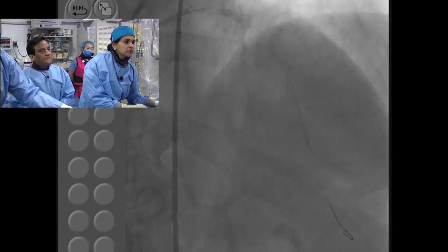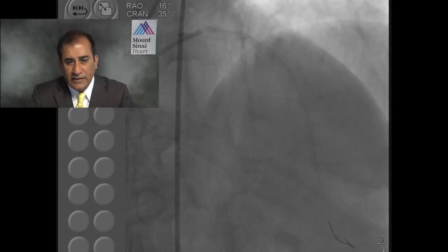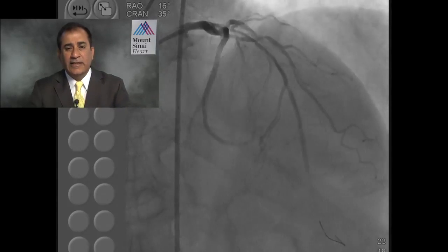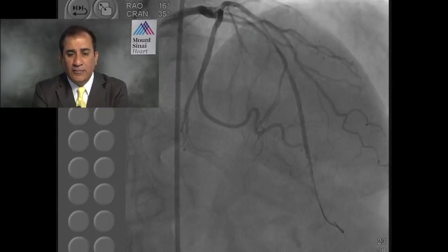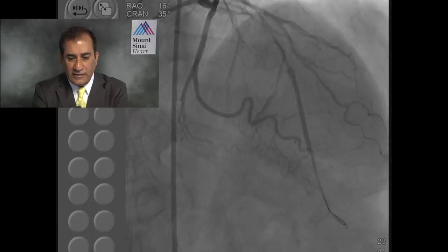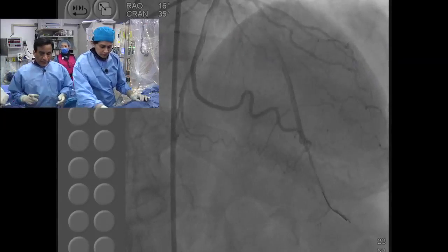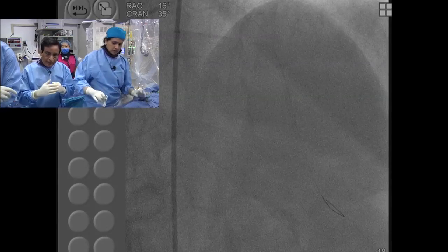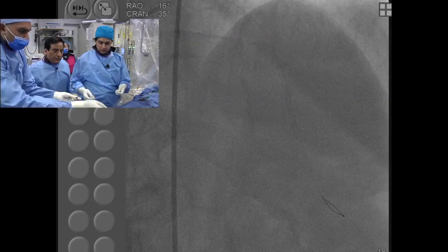I must very quickly qualify it here, Sameen, that people may have had a feeling, because the cases which we select are far more heavily calcified, that it may appear that your use of rotablator is higher. Yeah. But as you pointed out, those 9 to 10% is the overall incidence, which I think is exactly right. And patients are being referred to Sinai just for this purpose. And therefore, if the introduction of orbital atherectomy will close this gap of 2% to 9%, to me, I think it's a great service to our patients.